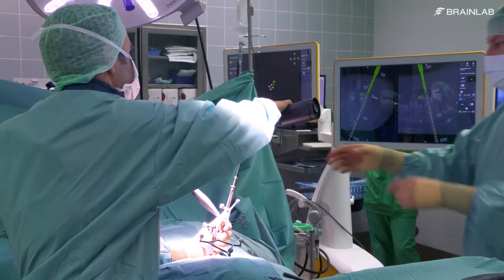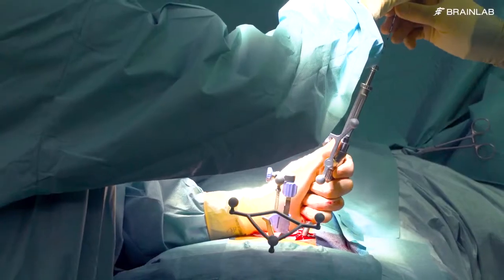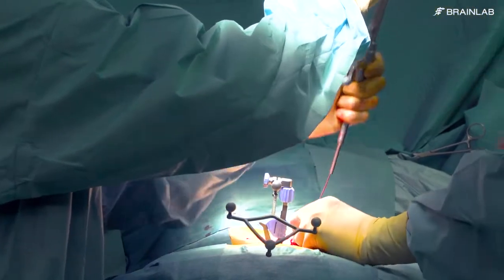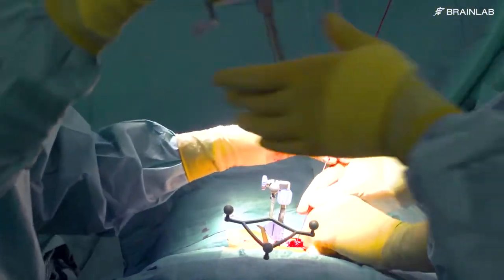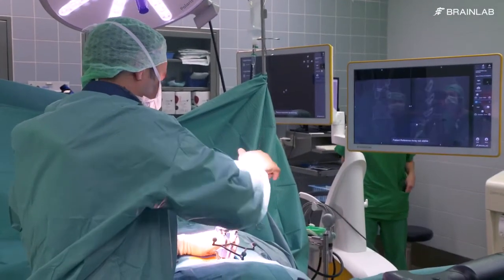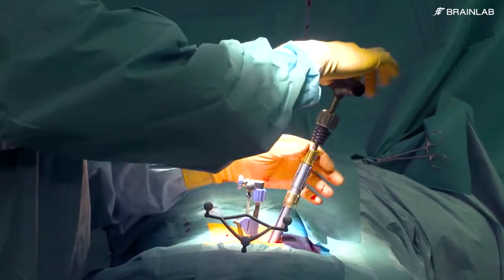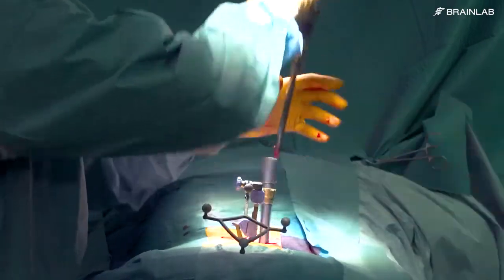The drill is removed and a K-wire is inserted through the drill guide. The drill guide is removed and the first cannulated screw is inserted over the K-wire and guided towards the pilot hole. After the screw is firmly in place, the K-wire can be removed. These steps are repeated for the remaining screws.